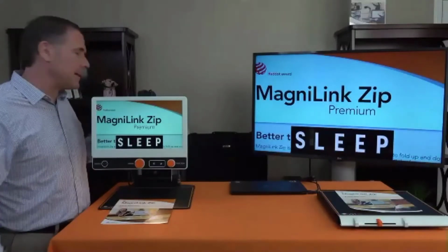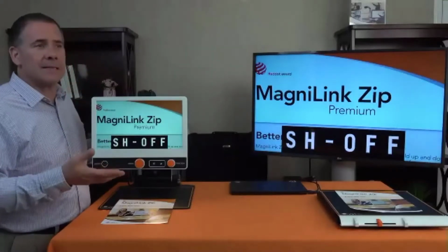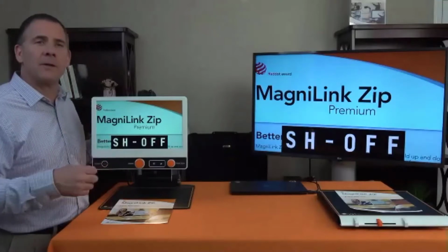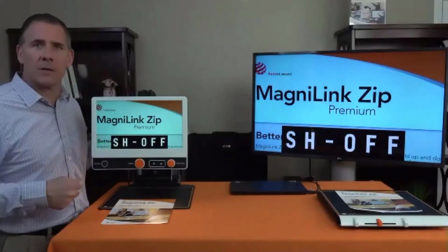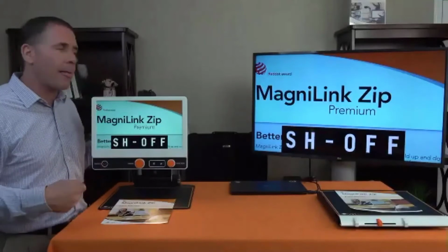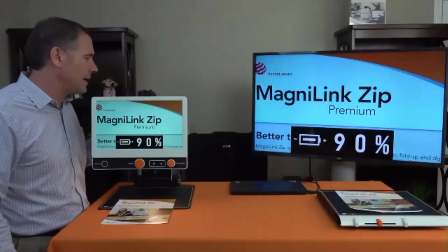Sleep. So that's sleep. The next one is shut it off. So say I set my sleep timer for every 5 minutes, if I'm not actively using it, it goes to sleep. I come back, it wakes back up. But in 30 minutes, if I haven't come back, all the power shuts off. That's also very good. The only way to get it back on is hit the power. Next is screen. I can change the brightness of the screen.